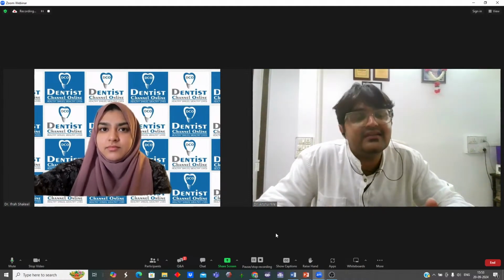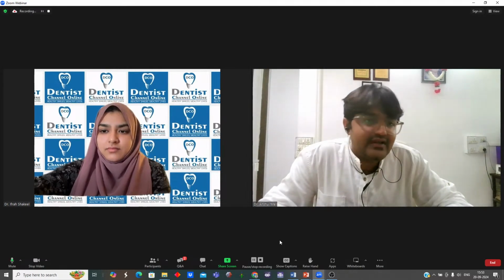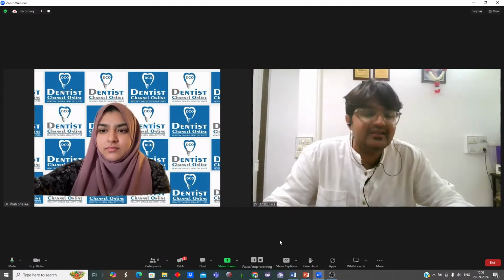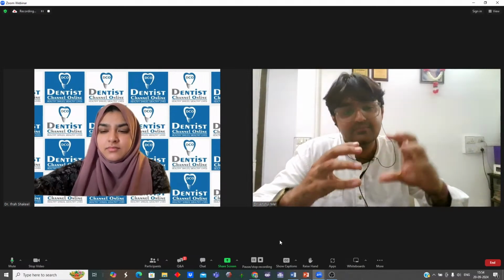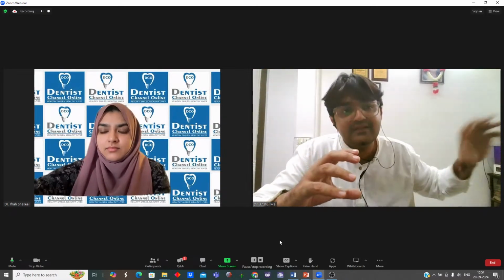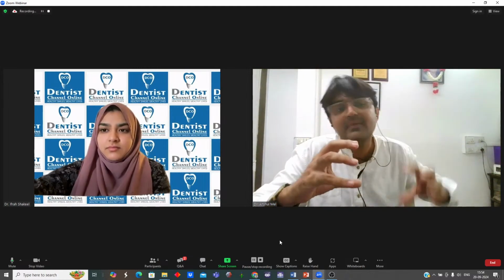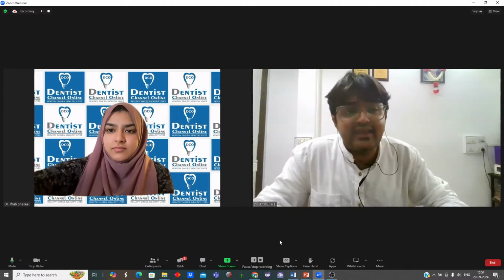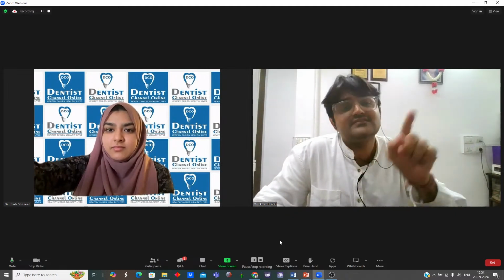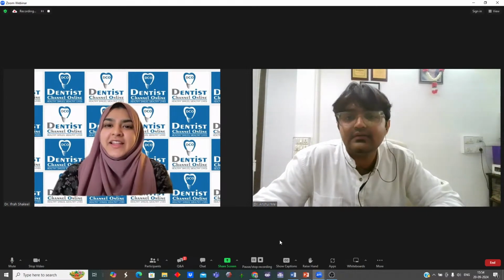So in 3D planning we have 3Shape and exocad, both software. Most commonly we are using exocad because it is compatible with all third party software, like for milling. After designing you have to go for 3D printing or milling, from the manufacturing point of view also, so it's more compatible with that. So I'm mostly using exocad for that, and always it's 3D. Okay, 3D planning.